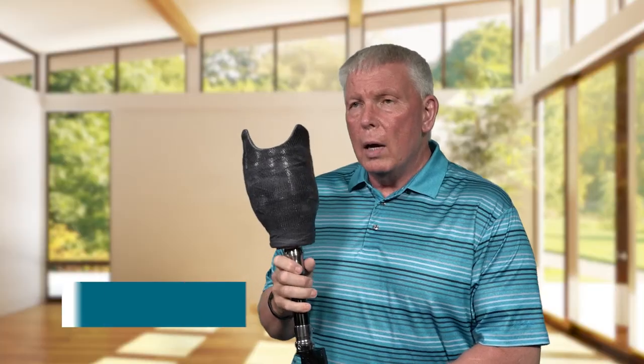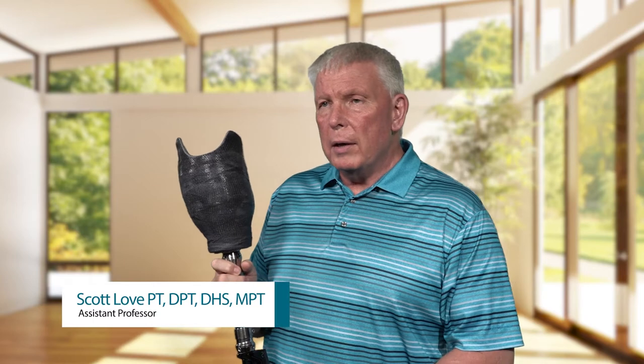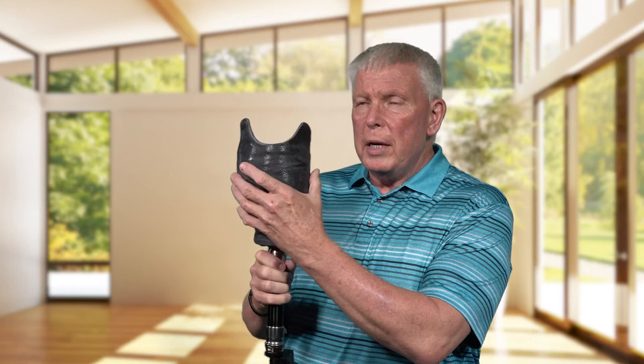That's the local prosthetic company named Bremer Orthotics and Prosthetics. They have a member of their team named Dr. Rick Coleman, who actually helps teach our prosthetic courses here at the campus. They reinforced the 3D printed nylon socket that Michelle Roy played with some fiberglass material just to make it stronger, due to the fact that we're going to a rural location in El Salvador, and we wanted to make sure that this socket was as strong as possible.